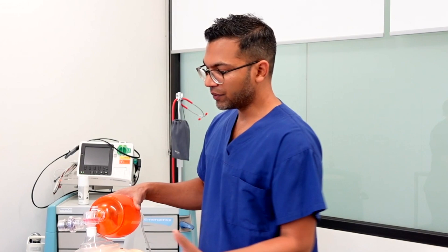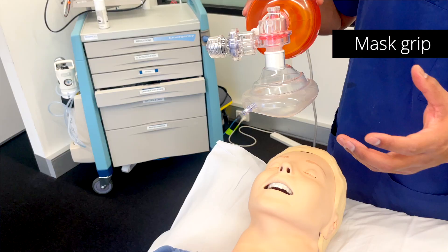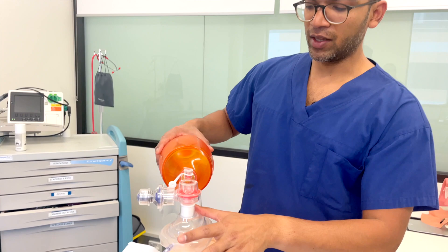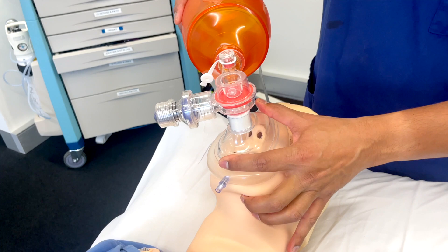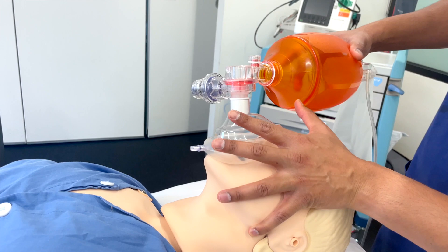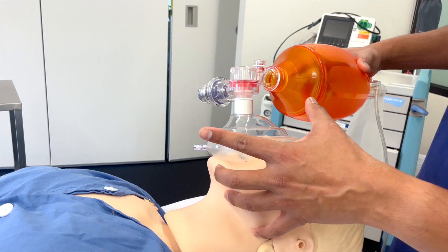The next thing we learn is the grip — the C and E grip. The C-shape is formed with the thumb at the top near the bridge of the nose and the pointer finger below it, creating pressure across the top and bottom of the mask. The E grip has my little finger at the angle of the jaw, ring finger along the side of the bone, and the middle finger at the chin. Importantly, these fingers aren't pushing into soft tissue — they're around the bone.